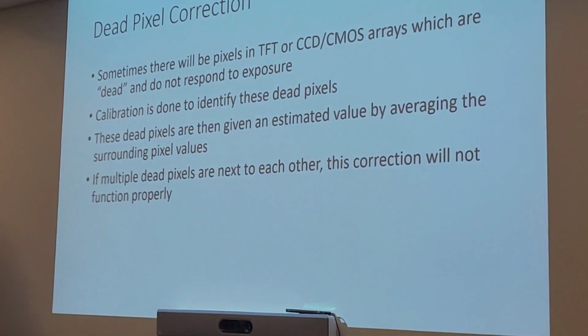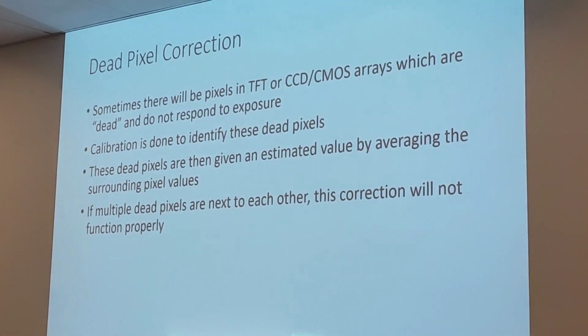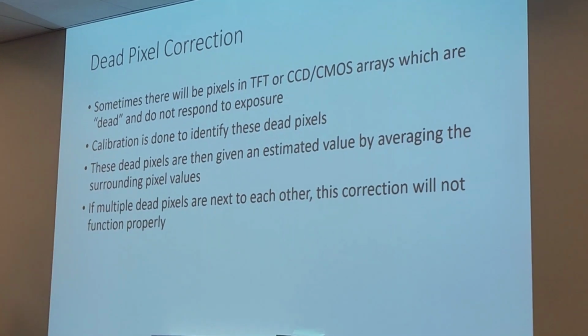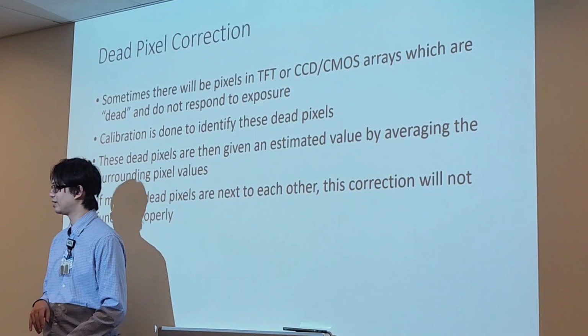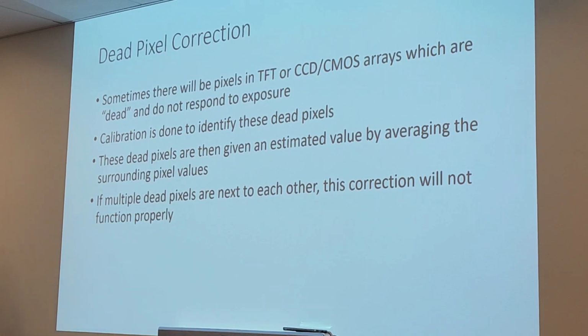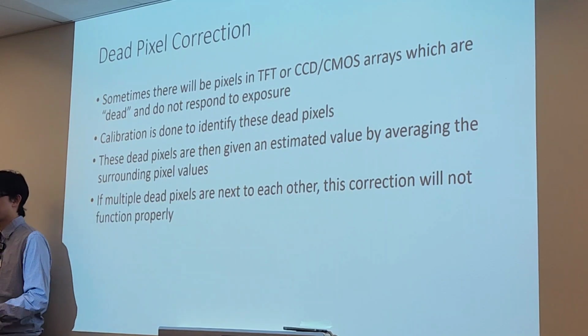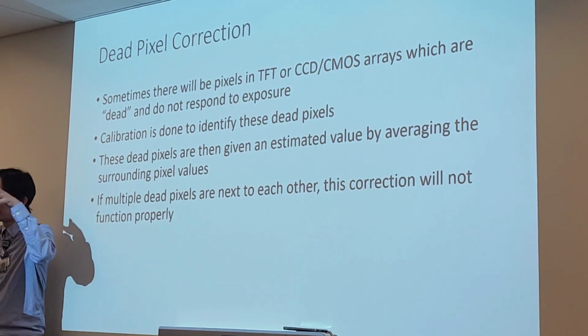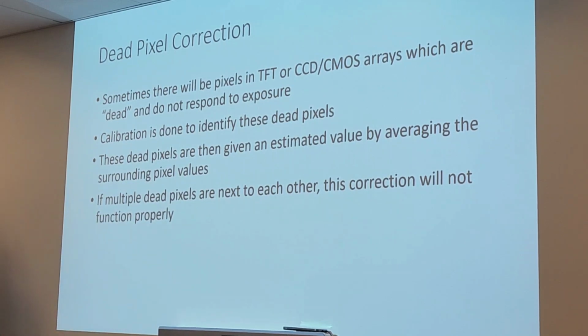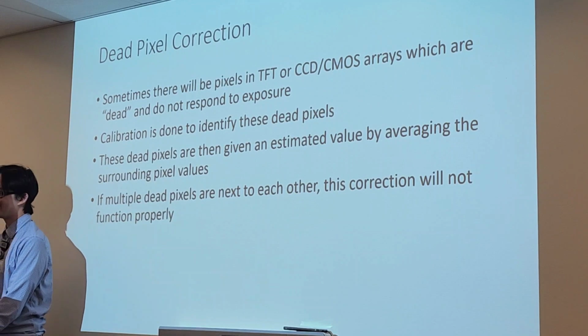What on earth is a dead pixel? Doesn't it detect exposure? It's dead. Right, so it's dead, it's non-functioning, it can't do its job. Like when you guys finish taking Miss Ponia's exam and then you come into my class afterwards, you guys are dead, right? You're not even functioning. So I'm trying to send information your way, but no information is being detected. I'm trying to send X-rays at these dead pixels, but no information is being detected.